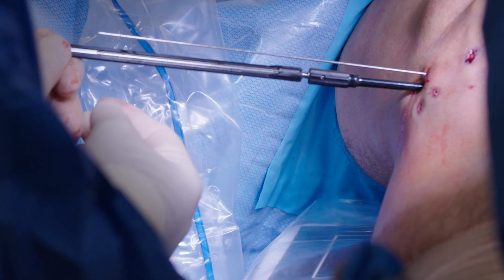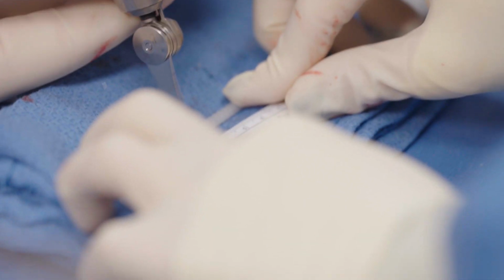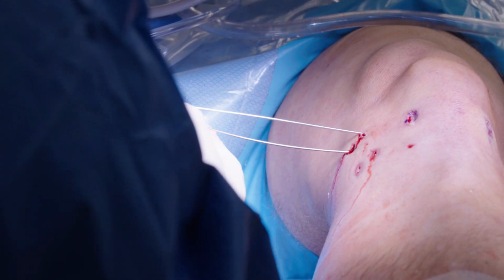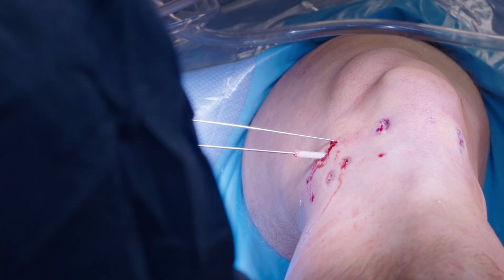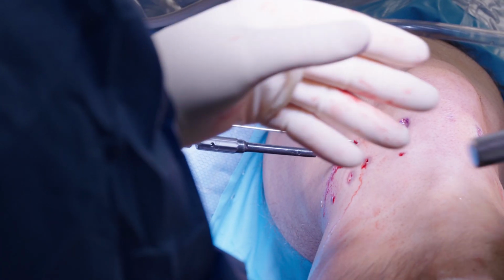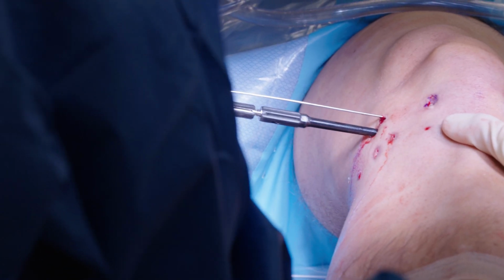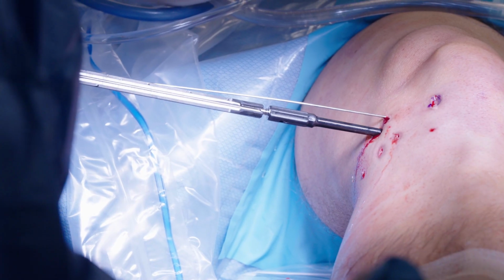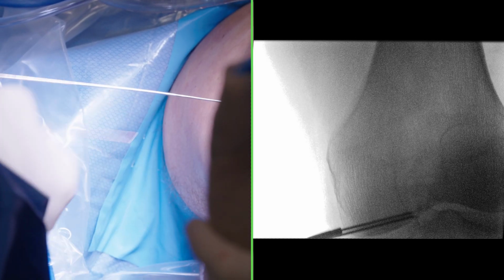Let's drill the anterior one now. First, we'll cut our 28. This is the posterior. Next, we'll advance the trimmable nail across the medial femoral condyle and make sure it's flush with the near cortex. Okay. Last nail, we have to cut it.